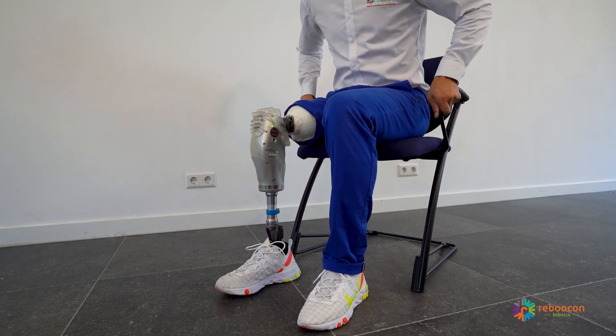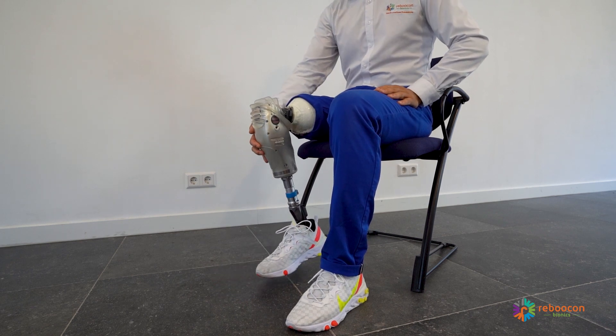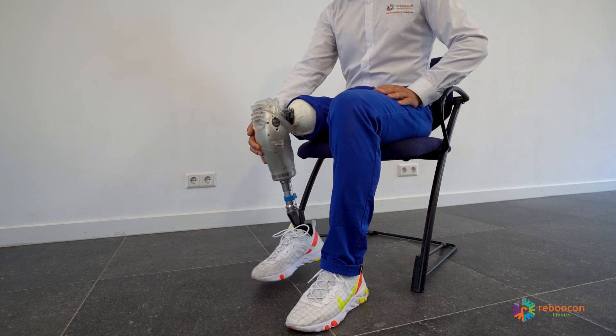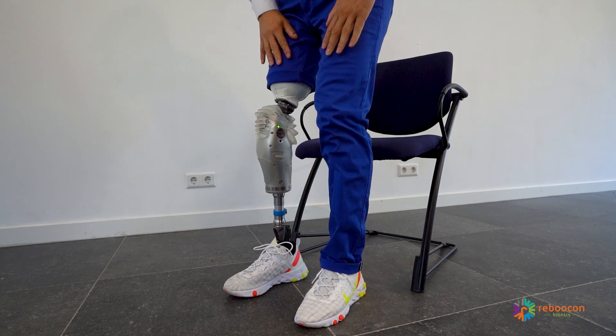While seated, the prosthesis switches to sleep mode to save energy. When standing up, the prosthesis wakes up instantly.